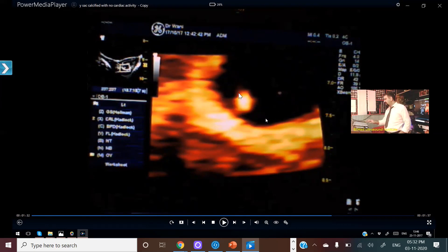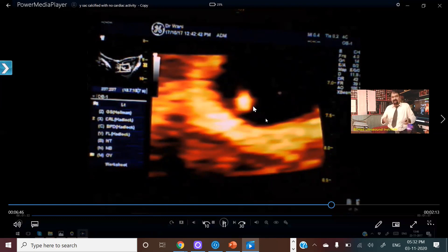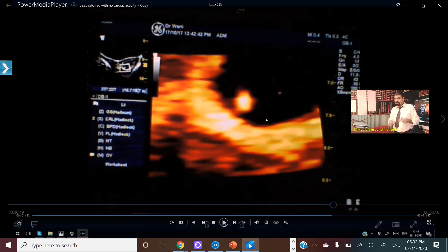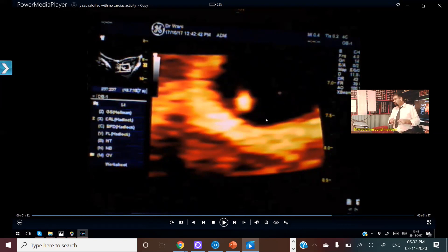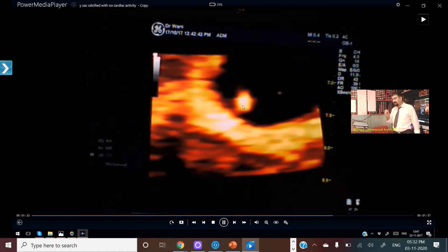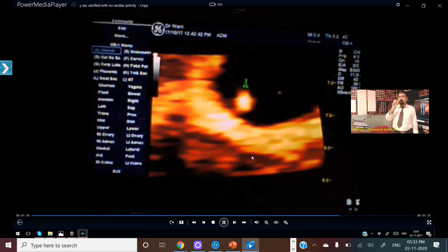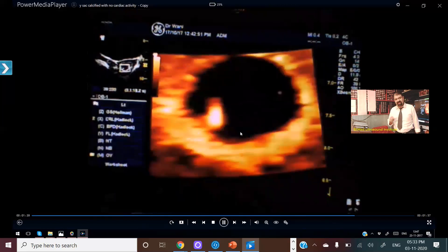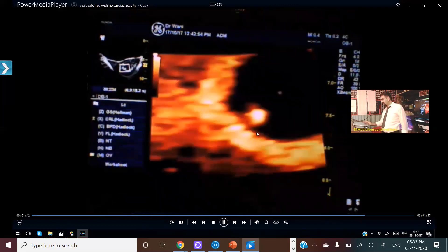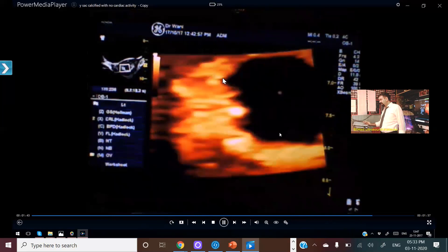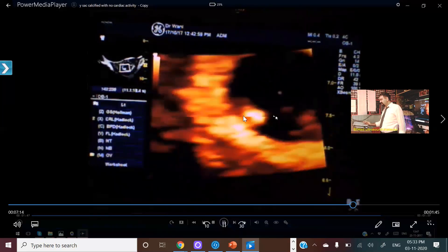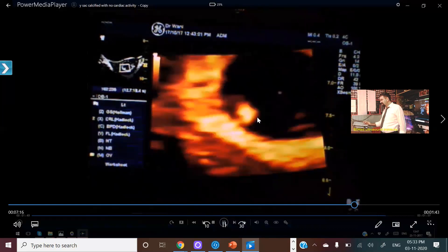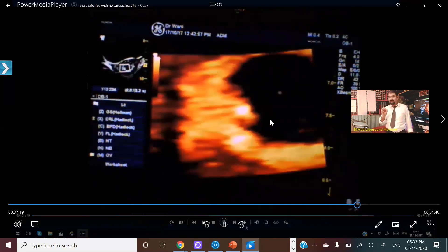You may think this is not a yolk sac because it is not looking like what you are expecting a yolk sac to be. So I have to see for the connection — that is the important point. I have to see for the vitelline duct. And if I find the vitelline duct, then this structure, whatever is there, is a yolk sac — and a calcified yolk sac. This is a transabdominal scan. Now I am seeing the vitelline duct over here, confirming that the above structure is the yolk sac.